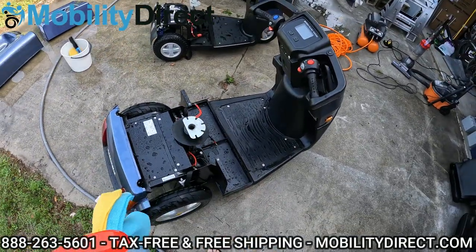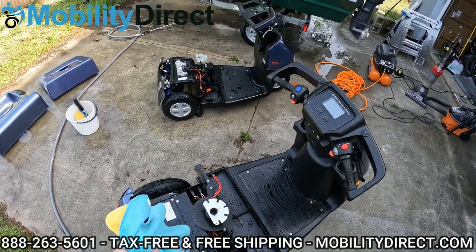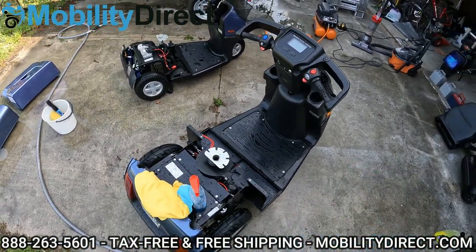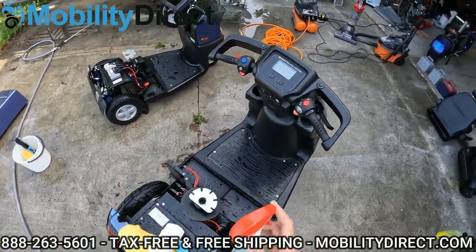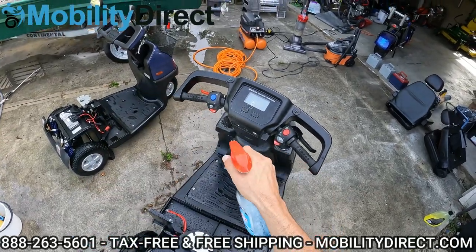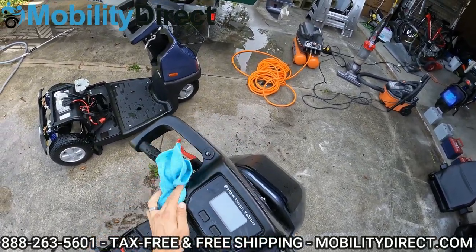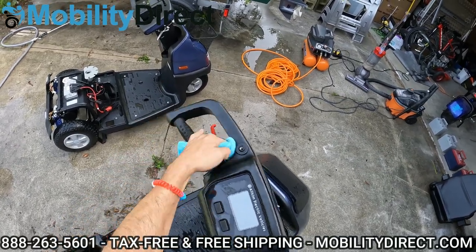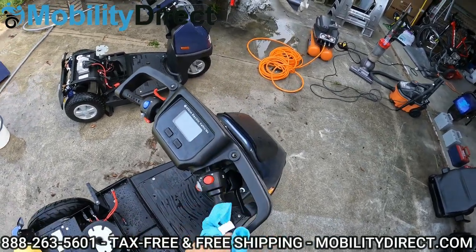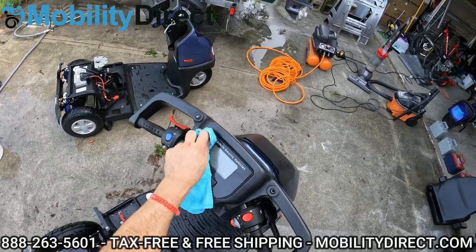All right, so to save time, I went ahead and washed down the C model in the same way that we washed down the S model. These are two pretty much the same models — one's just bigger than the other. What I wanted to do now is use a microfiber cloth. I'm going to lightly spray the dash area and the controls, because I never actually took the sponge and soap to the dash. It's a little dusty, so I'm just going to use some Windex, spray down this top part, and get it shiny. This is what we recommend doing to get that dash nice and shiny.